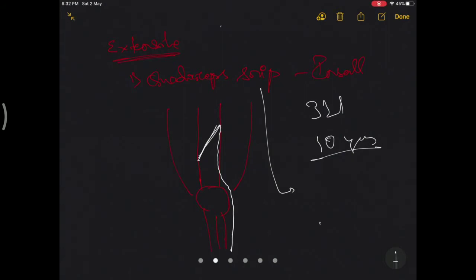And the risk of quadriceps or extensor mechanism ruptures was the same as with a simple medial parapatellar approach, or the approach with the quadriceps snip. So this is an effective way. Whenever there is an issue with the exposure, you can rely on this, and it's a little modification which will give you a lot.